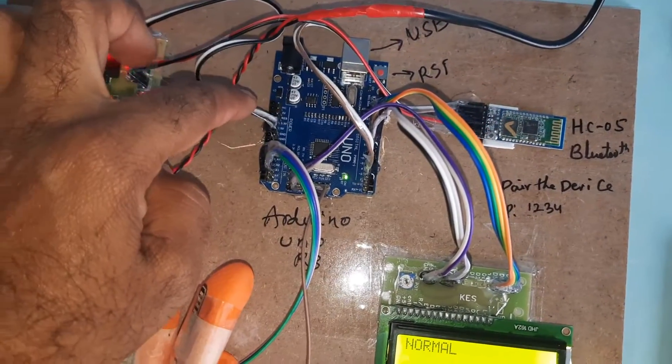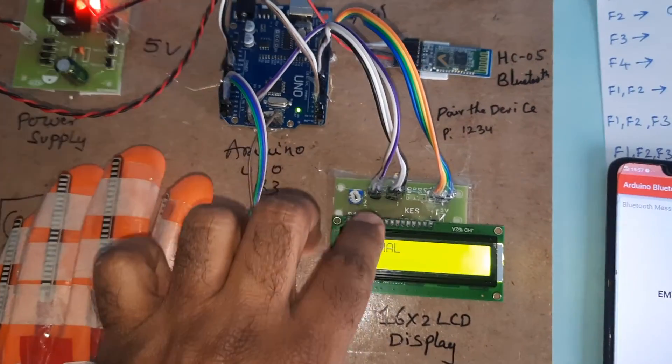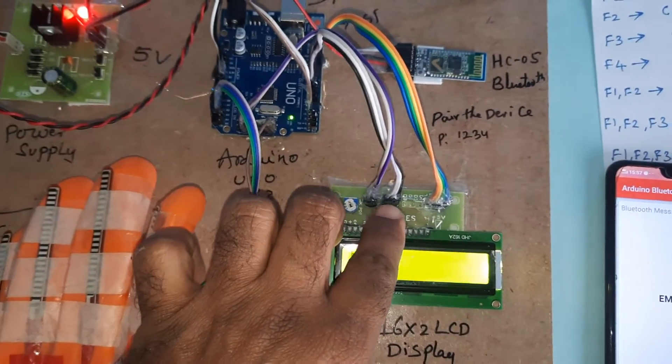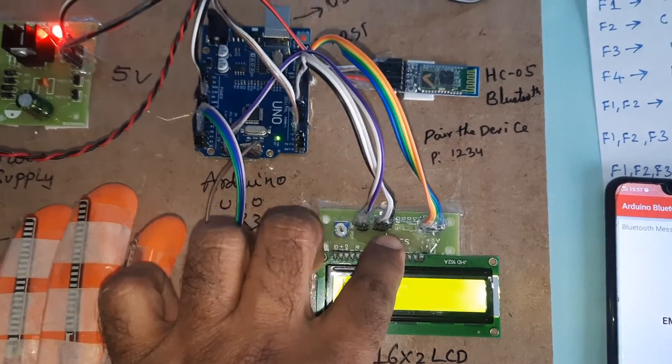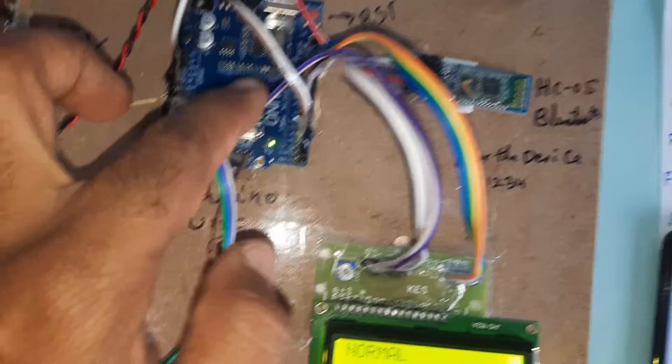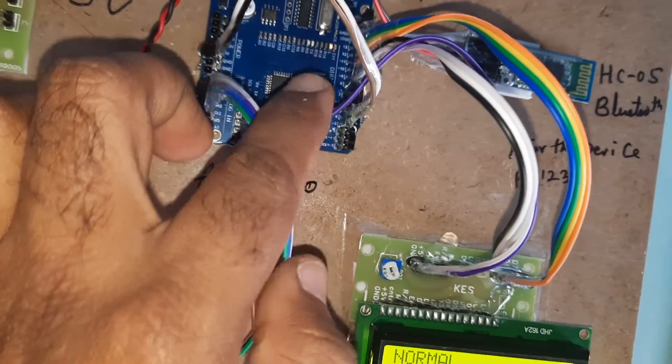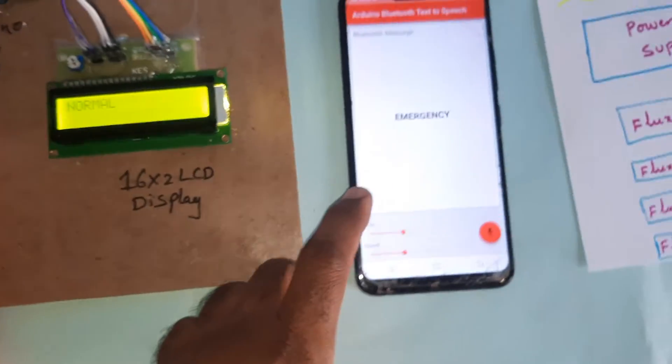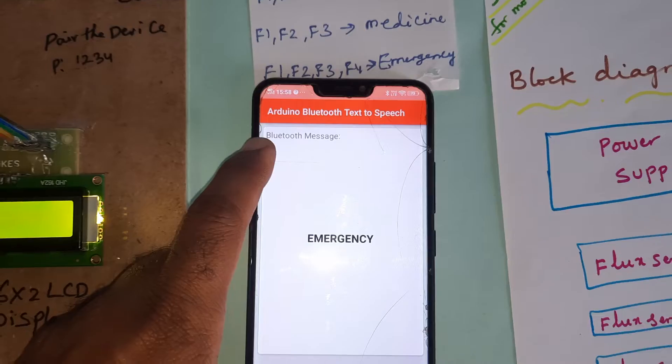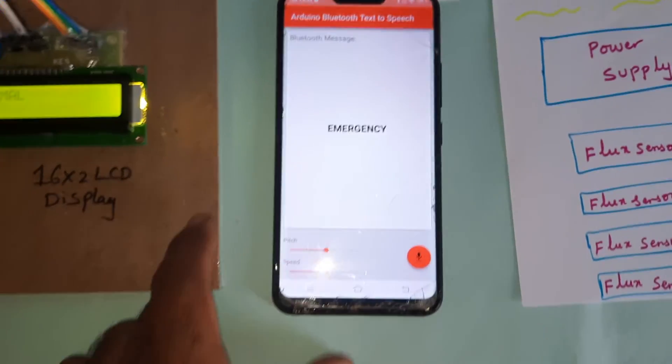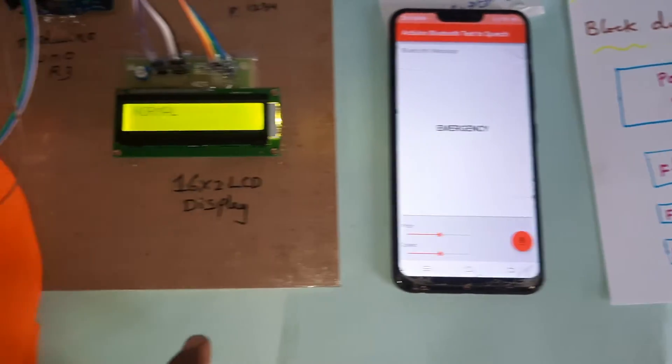5 volt power supply is connected to the Arduino 5 volt power supply, and pins 8, 9, 10, 11, 12, 13 are connected with the LCD display. Pins 2 and 3 are connected to the RX and TX of serial communication. Arduino Bluetooth text to speech is available on the Google Play Store.